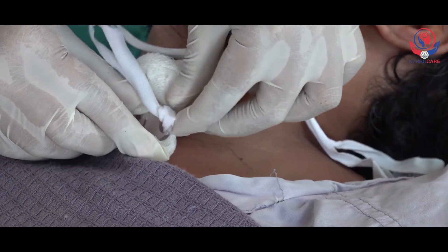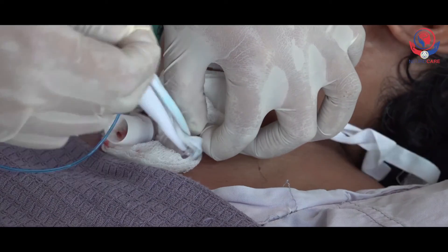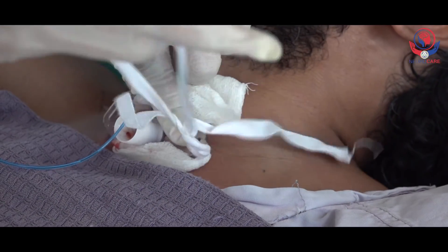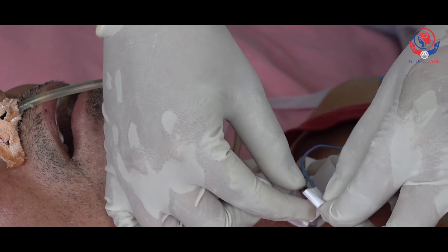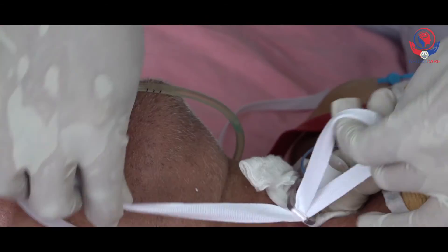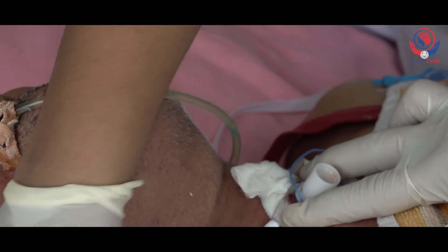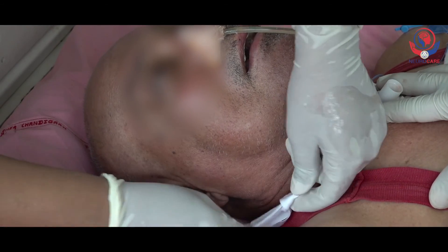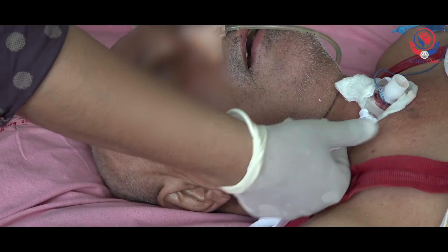Remove the previous ties, then using the dominant hand, thread one end of the new tie into the eye of the tracheostomy tube on one side and tie it. Bring the other end of the tie around the neck of the patient to the second eye of the tracheostomy tube and tie it properly. Do not fasten the tie too tightly — it should allow one finger to move freely underneath.